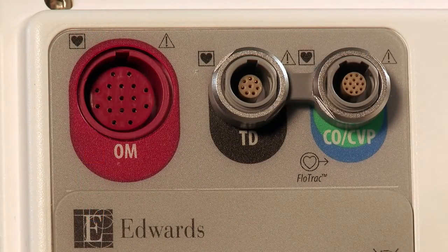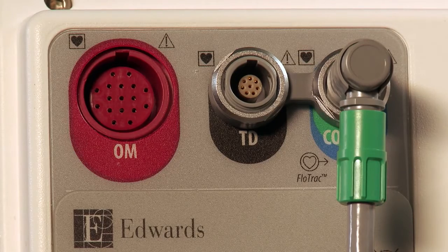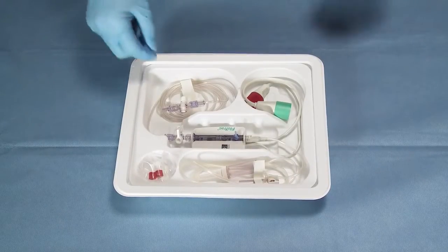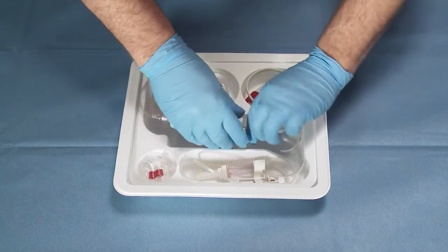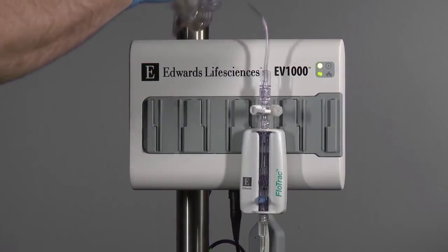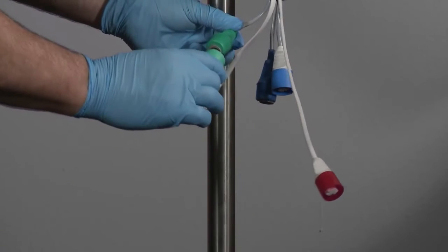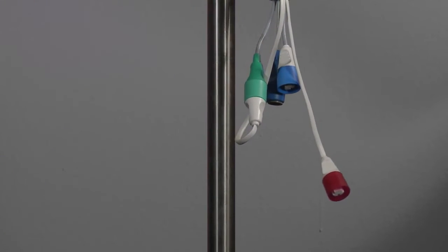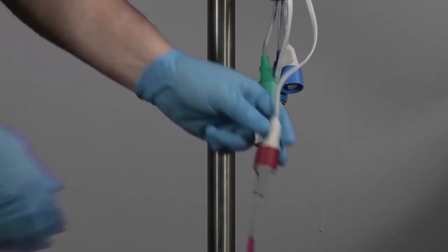Insert the trifurcated pressure cable into the green and blue color-coded CO-CVP pressure connection on the back of the data box. Open the FlowTrack sensor kit using aseptic techniques and check that all connections are secure. Mount the sensor on the data box. Connect the green EV-1000 clinical platform reusable pressure cable to the green connection on the FlowTrack disposable sensor. Connect the bedside monitor's reusable pressure cable for the arterial pressure channel to the red connection of the FlowTrack sensor.